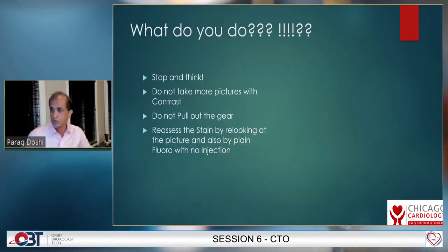At that point, you don't pull out anything. Stop and think. Absolutely do not take any more pictures with contrast. Do not pull out your gear. You need that gear in, your guide catheter, etc., to back up the damage. And you reassess the stain by relooking at the picture, and also with plain fluoroscopy. You don't need any injection.